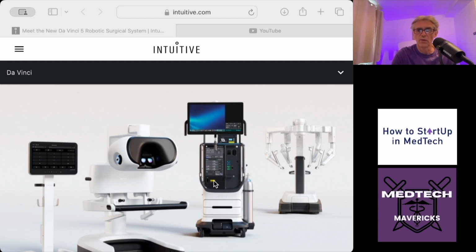And what you've got down here is where the main da Vinci camera system plugs in. So the light source and the camera plugs in down here, and that's a full near infrared today, Firefly, black and white. I'm convinced that there's a 4K full color white light ICG coming to this when they choose to. You got some gas bottles here.